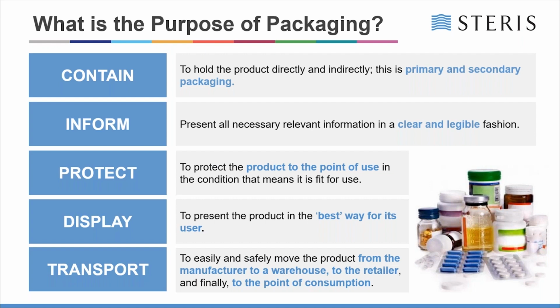To protect the product to the point of use. And the point of use can be at a clinical trial site, at a doctor's surgery, in a theatre. It can be absolutely any place. Again, you need to be able to ensure that the product remains intact and sterile to that point of use.